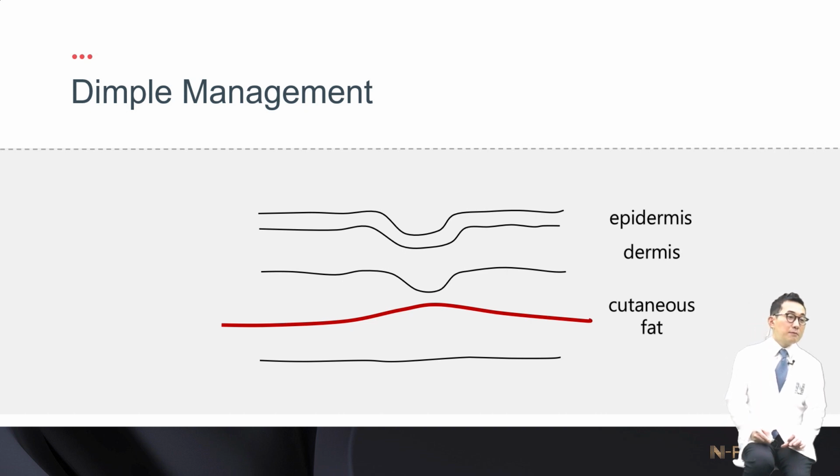When doing thread lifting, you may want to avoid making a dimple, but you can't always avoid it. But actually, a dimple is not always bad. Having a dimple means that the thread is surely fixed as well. So when it comes to lifting effect, a dimple is by no means a bad thing. However, it will be difficult if it occurs in visible areas.